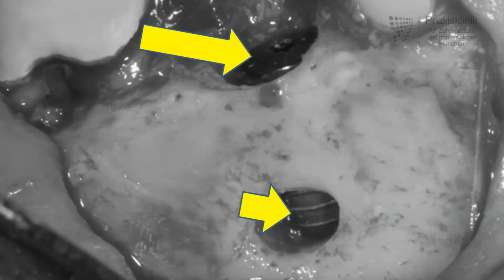And of course, if you take out the tooth, it has a different anatomy from a round implant. It is more an oval shape or rectangular shape, depending on which tooth you take out. So of course, you have to close both holes with any kind of grafting material.